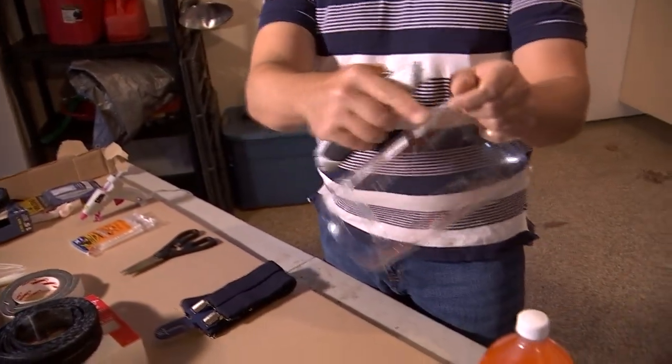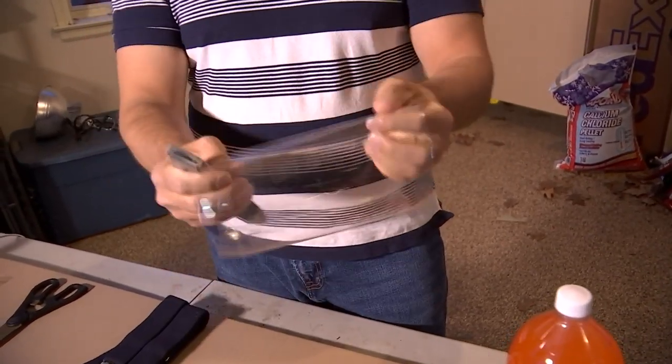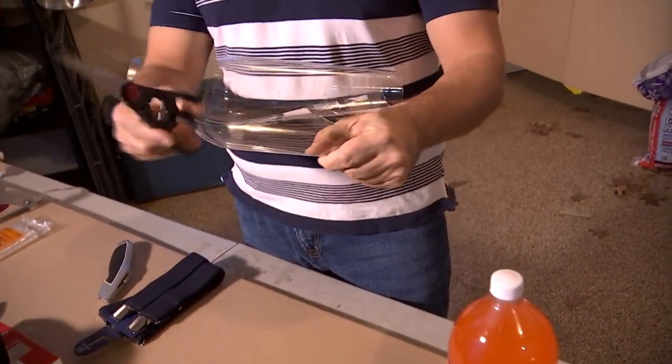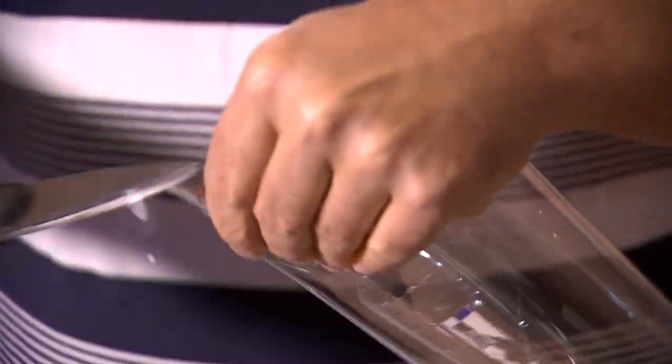Next, find the glue seam on the bottle, take your knife, and cut straight down so it'll wrap open. Then, to be safe for your doctors, cut off the little corners because those corners can cut skin — just round them off.